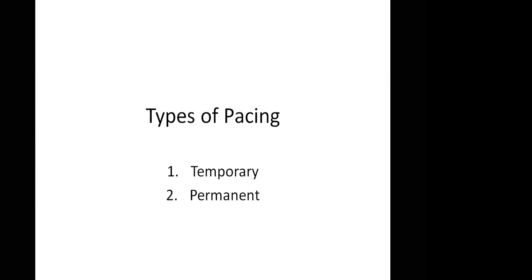You are seeing the second image, right? Yes. Just look at the ECG on that machine. Under the green, the ECG is green, right? Lemon, sorry, sea green. So you can see the purple line, the vertical line under that ECG. That's the P. You are seeing the P there. That's the pacing spike. Well, I'm just trying to emphasize that you can pace from the surface.